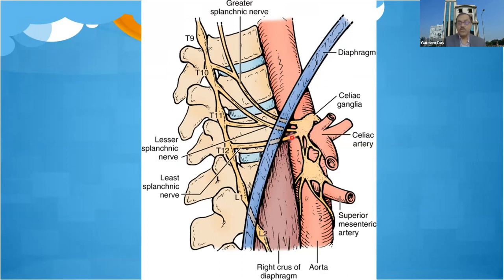And if you are going through the aorta, then it is called transaortic. Or if you are not going through the aorta, we can put a needle on this side and another on the other side. That is your classical Kappis approach. So there are a lot of different approaches. I'll be showing you when I'm demonstrating the procedure.